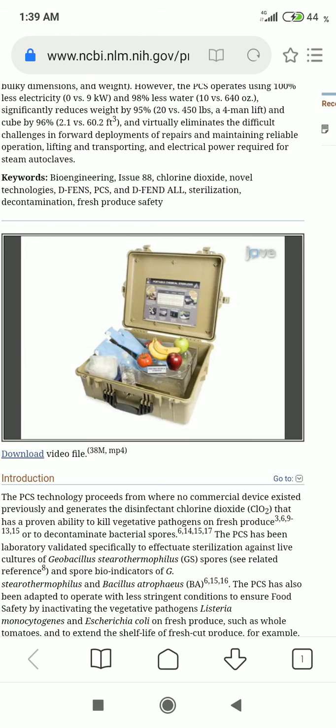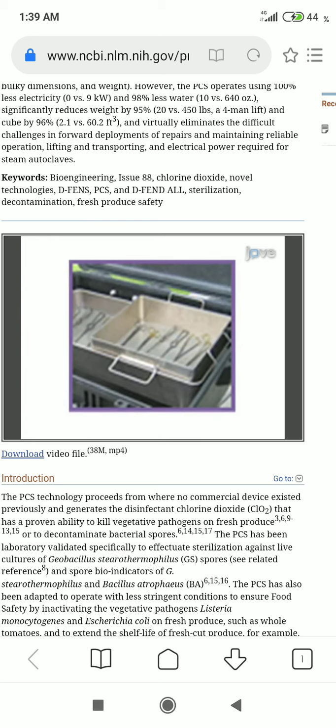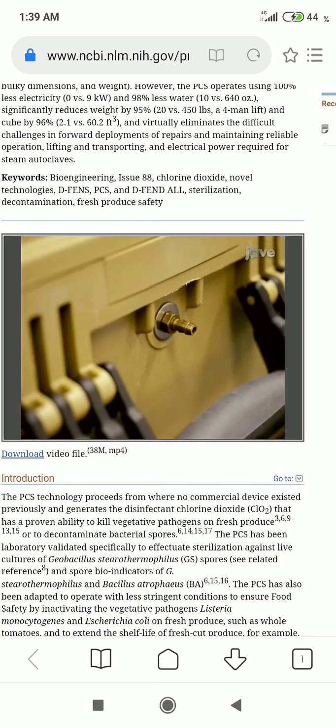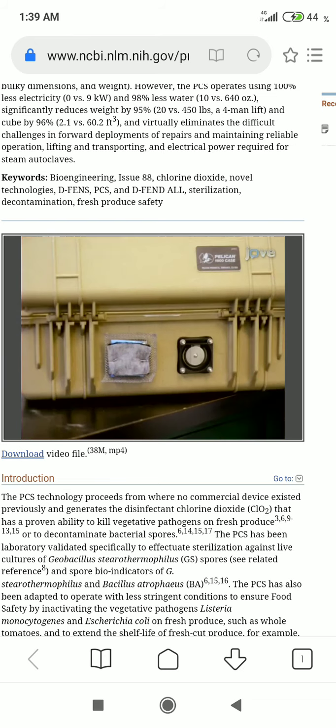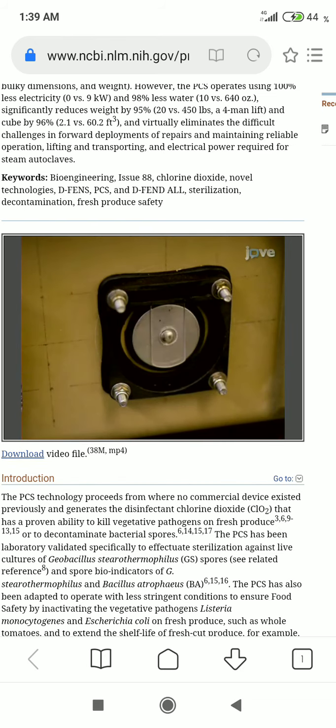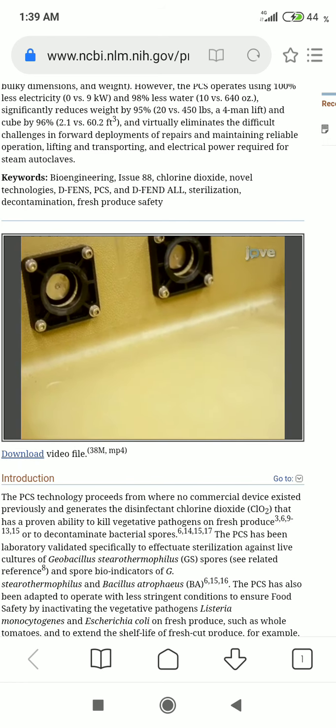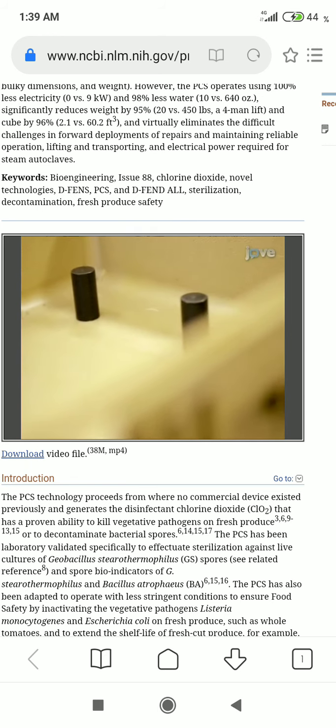The PCS is a medical sterilization device that is portable, energy independent, and has potential to become a disruptive technology as a modern field autoclave for forward medical units. A commercial Pelican rigid plastic suitcase was embellished with a number of special design features to accommodate a novel set of simple chemical reagents that react and produce chlorine dioxide to effectuate sterilization.